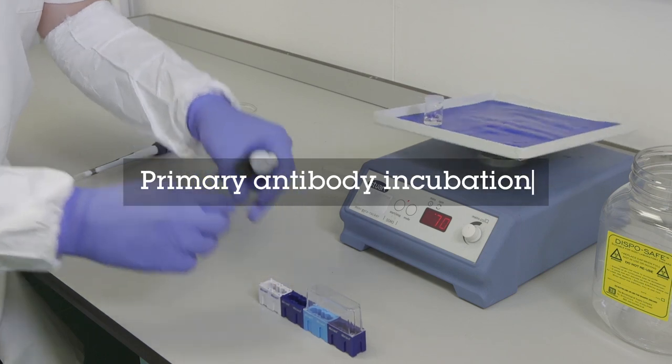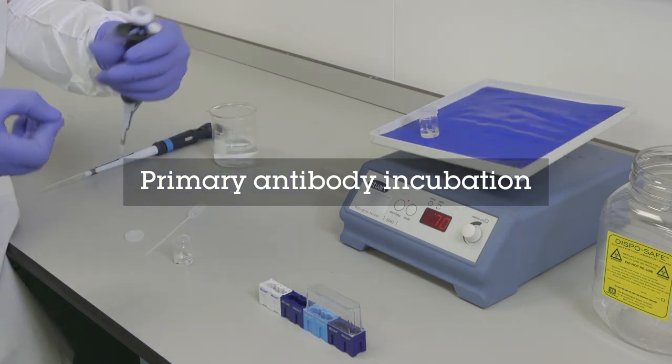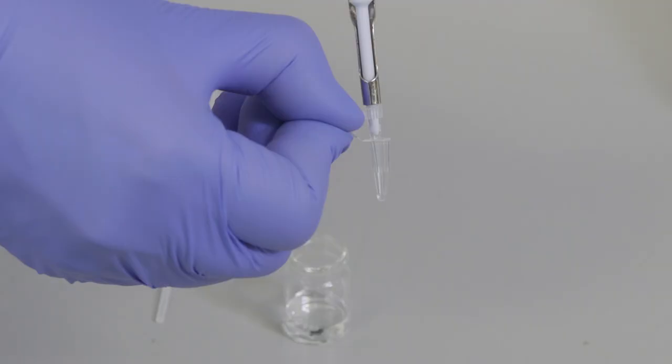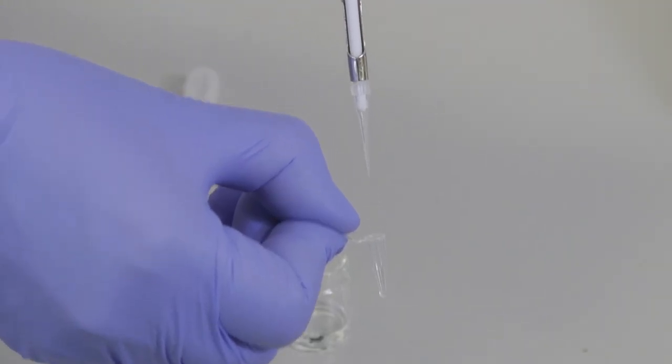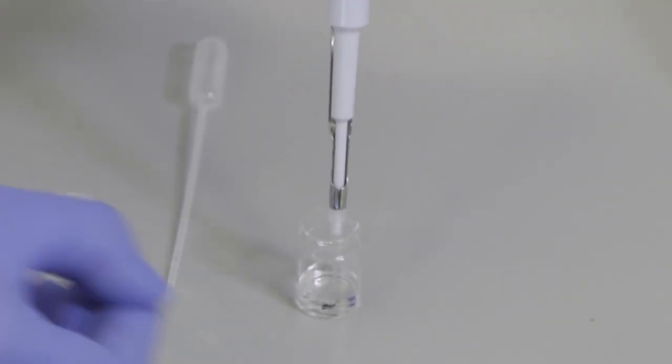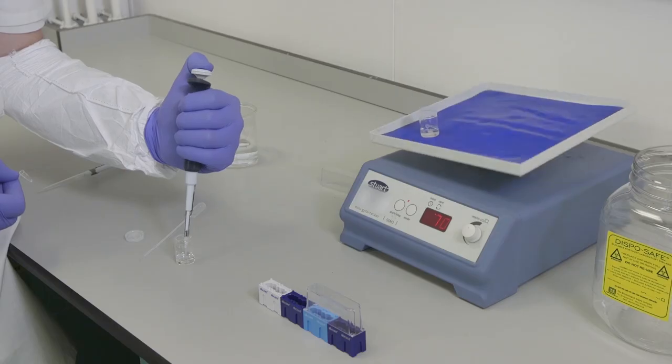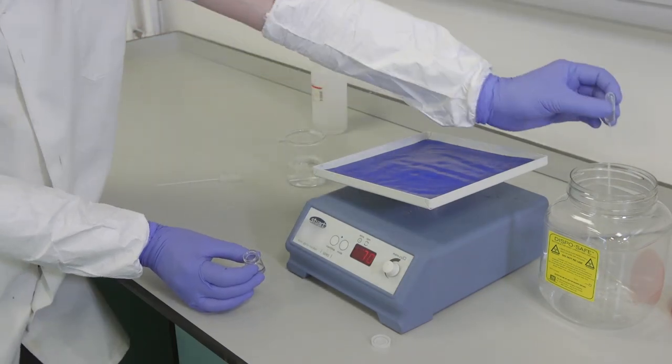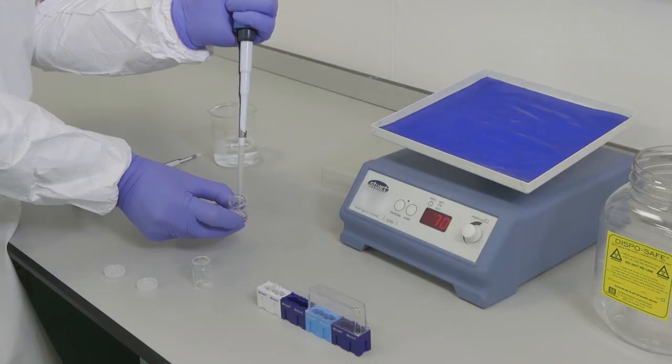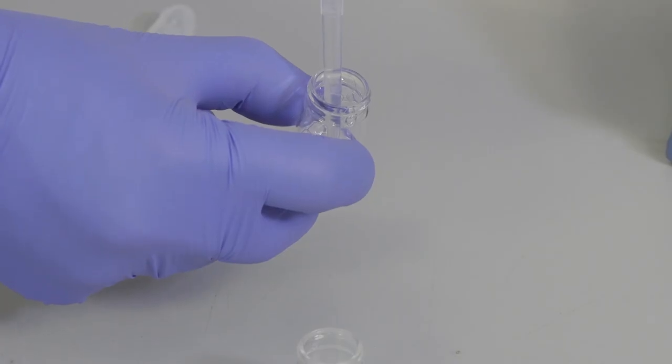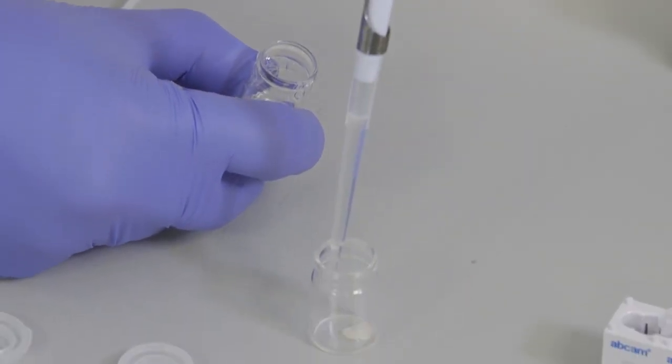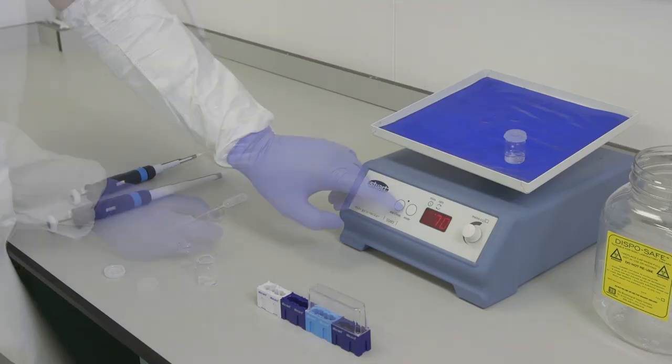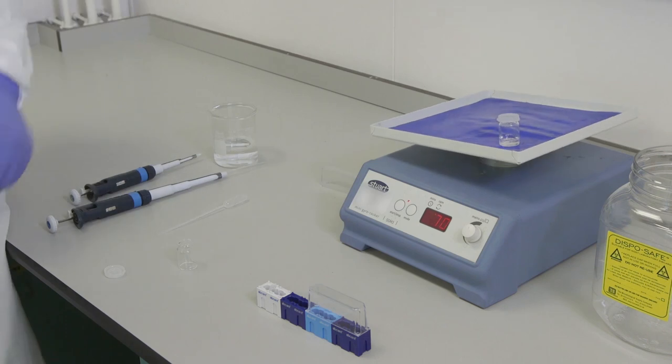Prepare the primary antibody solution by diluting the primary antibody in the Tris Triton solution to the correct dilution factor. A good starting point is the guideline provided by Abcam with the product, but it is recommended to optimize this for each antibody used. Remove the blocking solution, do not wash, and add the primary antibody solution to the brain slice. Leave it to incubate overnight under agitation at 4 degrees C.